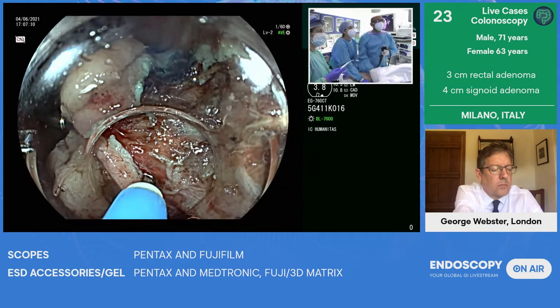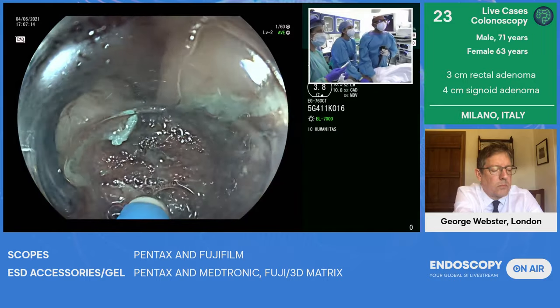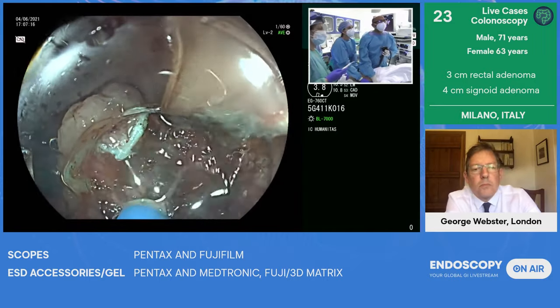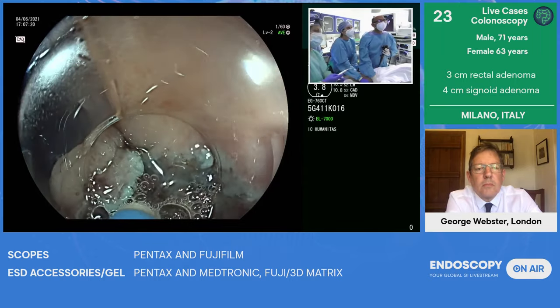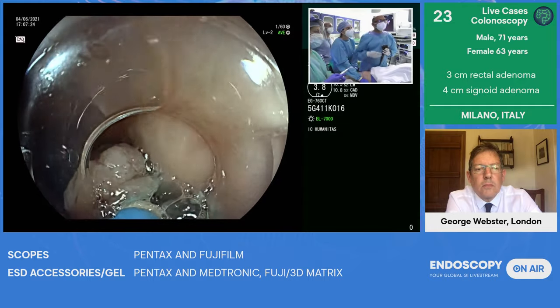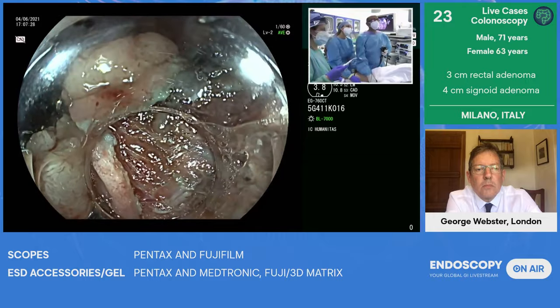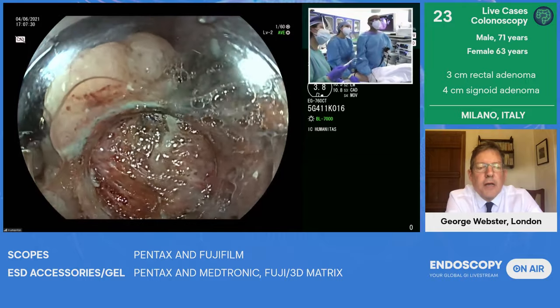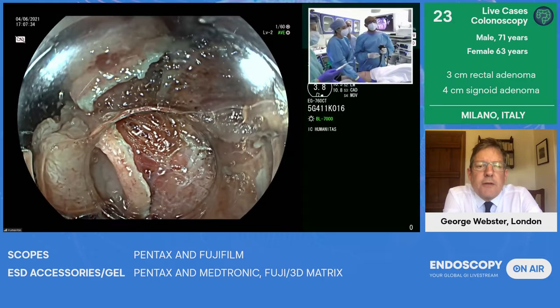And now the endoscopist has to use this plane and dissect, stay parallel to the muscle. Okay, and we come back. You see, George, it's opening up. You agree? Yeah, very nice. And no risk of too much traction.